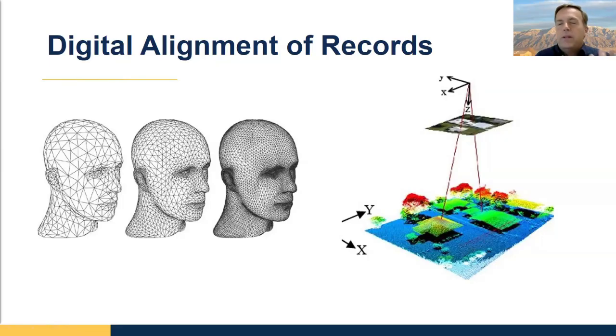When we stack them, we take two files that have different origin points. We find common locations on the two. We tell the software, okay, these areas are common, and then it'll show us a map of how well things match up. We make a determination as to whether it's good or not, and then we say align. When those two files are aligned, now their origin points are the same too.